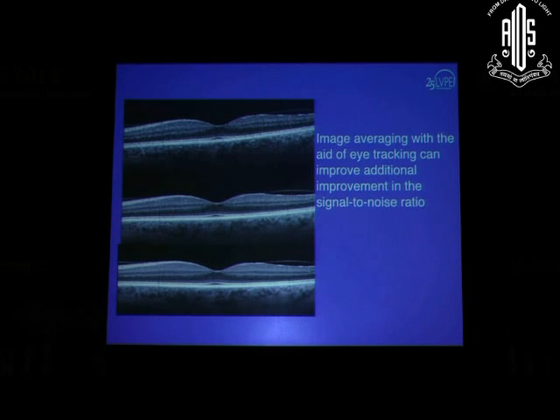There are many OCT machines which give you this option right now. Some of them will give you multiple scans taken at the same time. Some of them will give you only one line scan which can be taken at a higher number of scans. If you look at a Spectralis machine, you might take 7-8 scans, and it can go even up to 100 times averaging. Whereas a Zeiss machine might give you only 20 times, and only for one line scan. That is another way of looking at it.